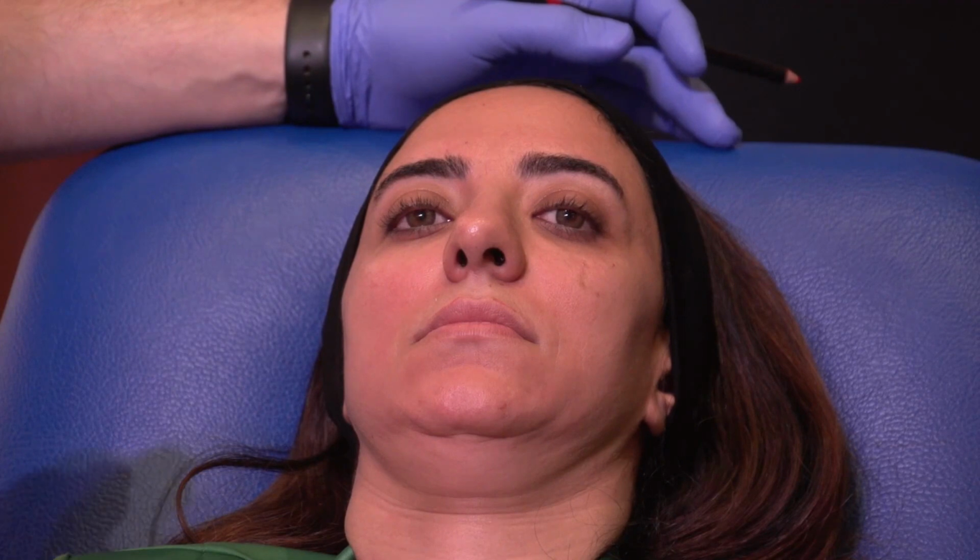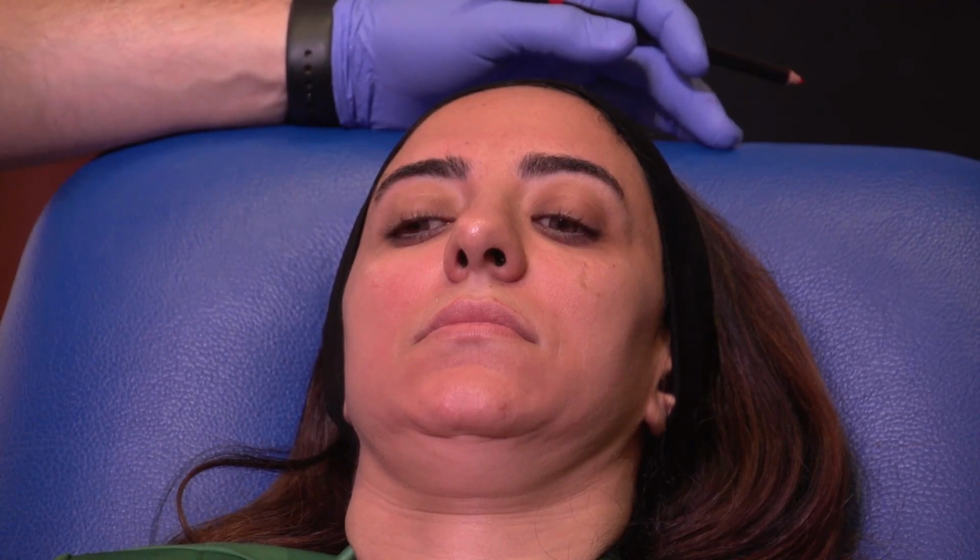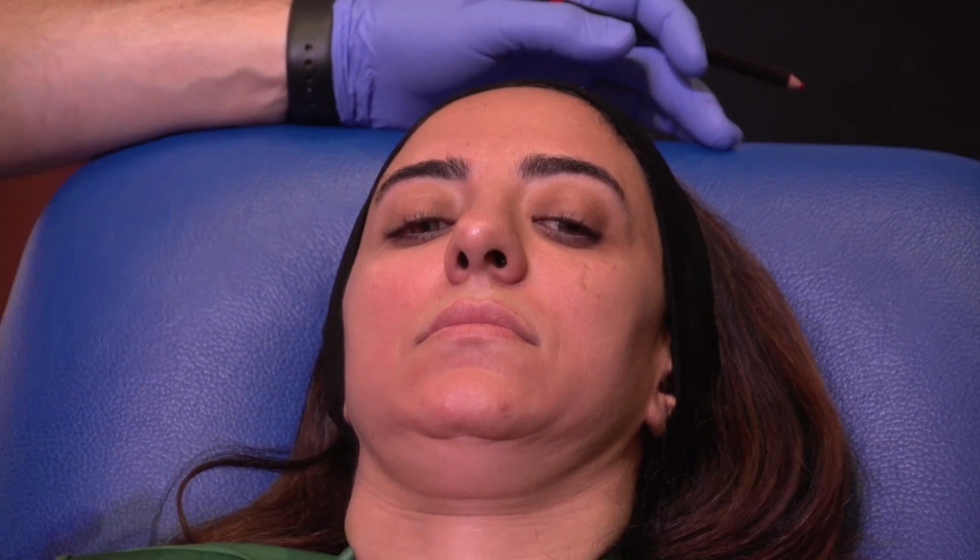And if she does have that, and she's not interested in changing the shape of the lip, I would just augment the whole lip. You have to keep in mind the balance between the upper and lower lip. The lower lip has to be slightly bigger than the upper lip. Her main concern was that the upper lip, when she smiles, almost disappears. So we'll try to treat that with the fillers today.